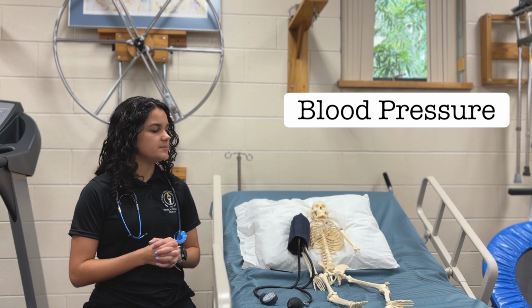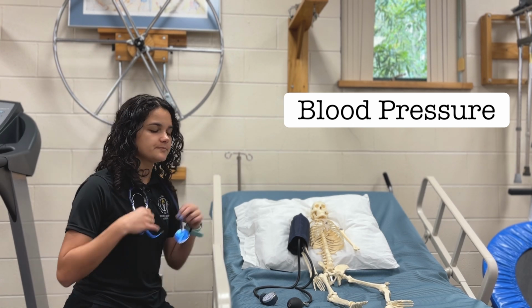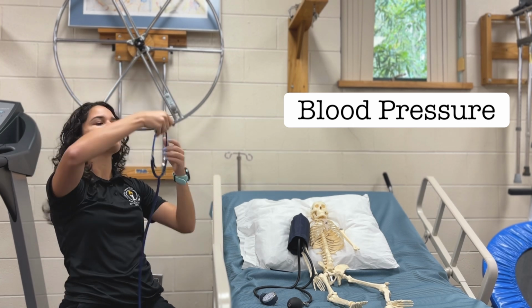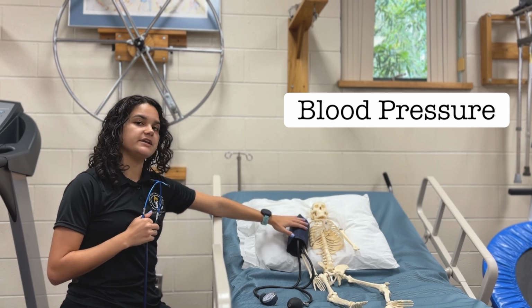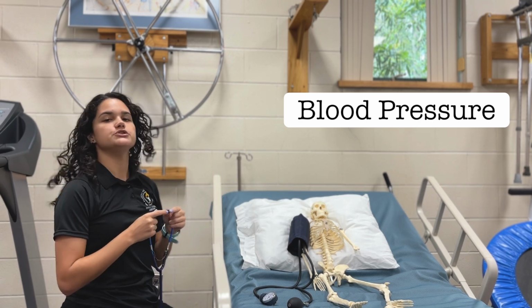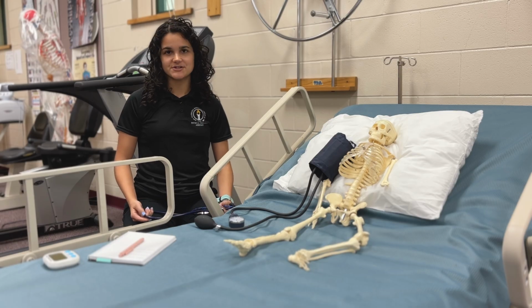In order to begin to take the pressure, you will need a blood pressure cuff or a sphygmomanometer, as we mentioned earlier, and a stethoscope. I am going to place it on the brachial area of Mr. Skella's body here, on his upper arm, because I'm going to use the brachial artery to hear that pressure against the vessel walls. Now let's measure his blood pressure.